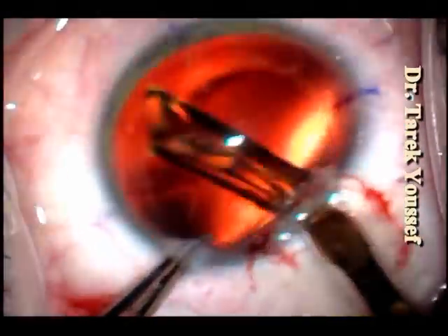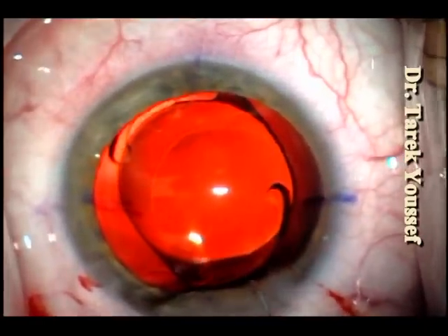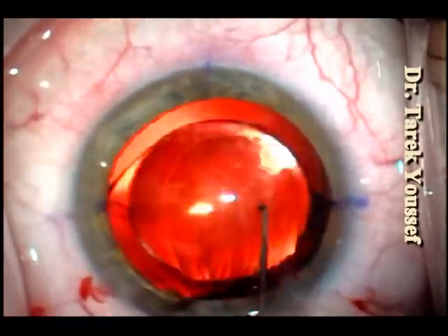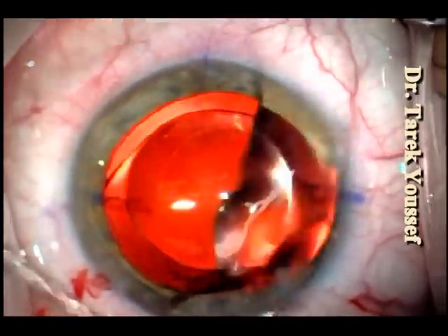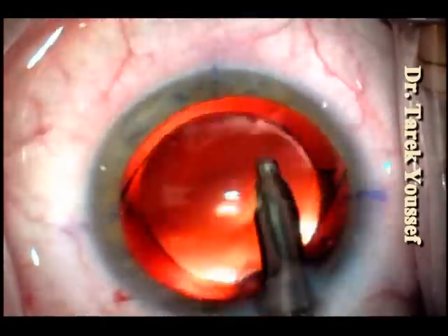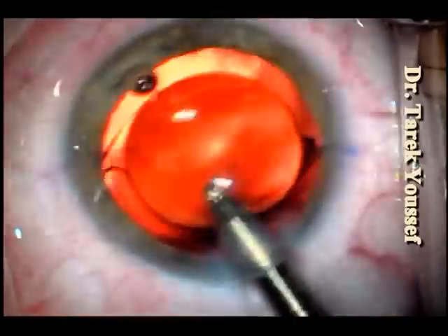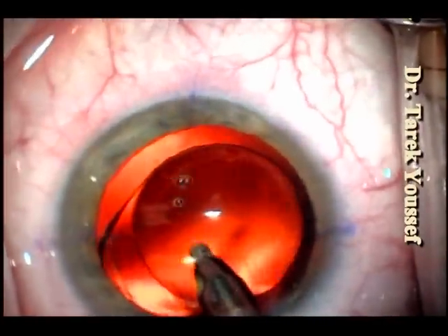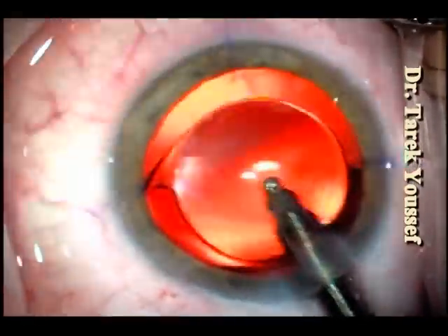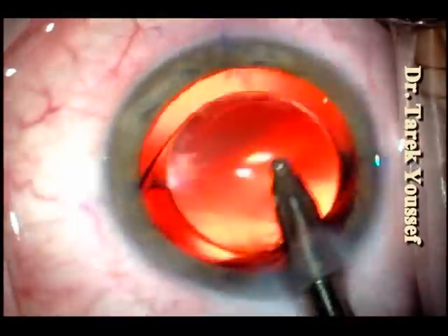With the Alcon lenses I don't go through the wound as my wound is 2.85 millimeters and the cartridge does not fit through that. I usually put the lip of the cartridge on the lip of the wound and inject the lens through without having to insert the cartridge or widen the wound. The lens is in — I'm going to align the axis of astigmatism with the axis of the cylinder of the lens, doing irrigation aspiration. I'll leave the lens about 10 degrees short of the target, as sometimes after this step it can rotate a little bit and it's easier to rotate it afterwards.